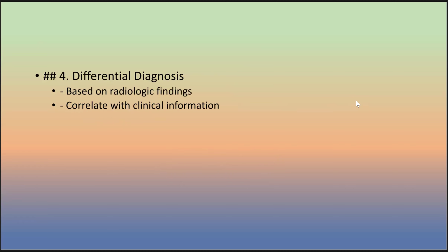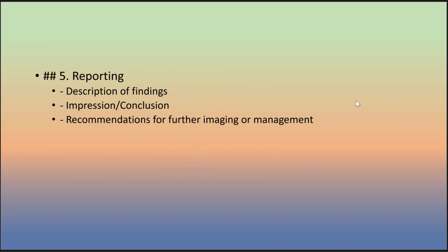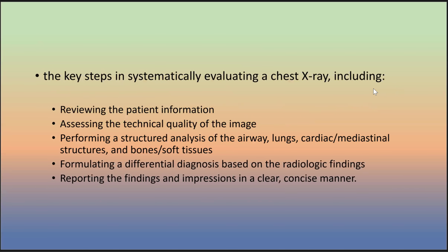Differential diagnosis based on radiological findings and correlate with the clinical information. Then lastly, he wrote the report. He said: description of the findings, impression, conclusion, and recommendation for further imaging and management. These are the key steps in systematically evaluating a chest X-ray.